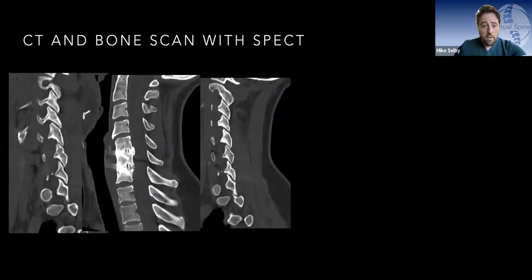So this was her CT when it came to revision in 2023. And you can see here, and again, this was called fused, that the facet joints at those levels, which I've put on the left and the right there of the central sagittal image, are clearly not fused. And so that always to me is a sign, if the facet joints have not shown any changes in terms of spot welding or anything like that, that there is a potential issue there.